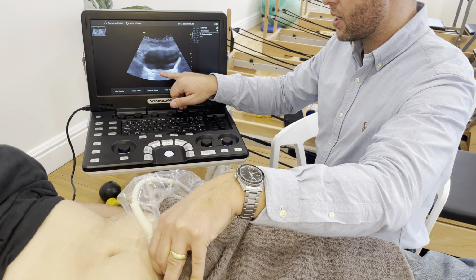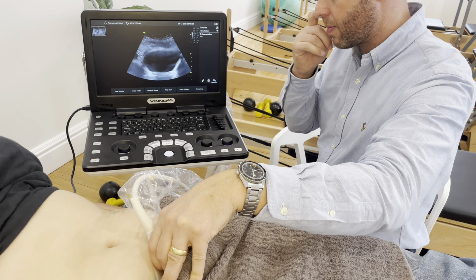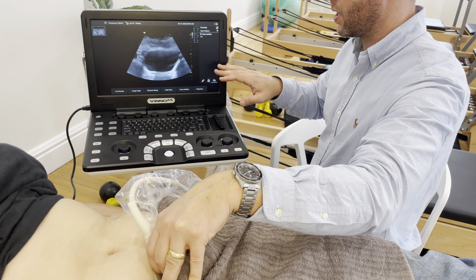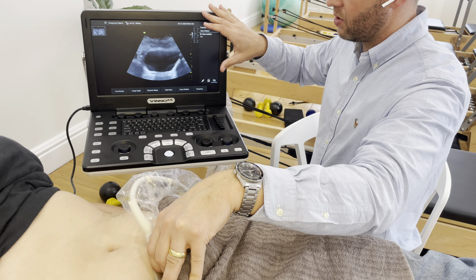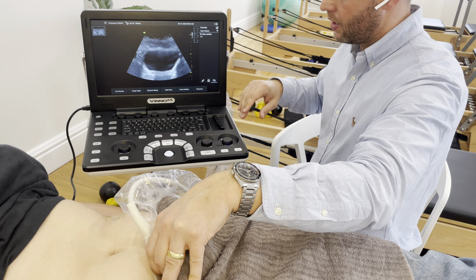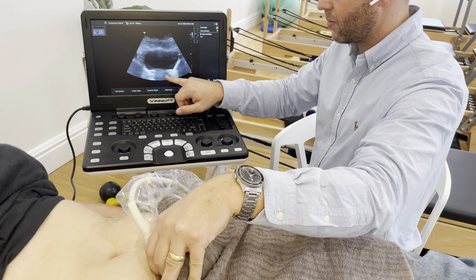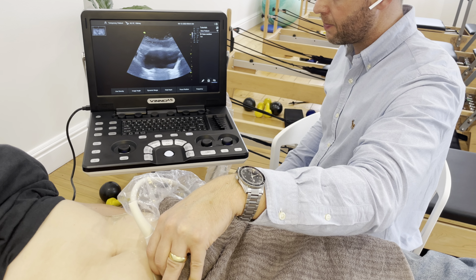So when we ask the patient to do a bladder contraction, we're looking to see what happens at the base of the bladder here. Usually I'm going to get the person to just do some, yeah, I see a little bladder elevation there, but let's just do some relaxed breathing first of all. With a deep breath in, we usually see the bladder drop, and with a breath out, we see the bladder come back up. Okay. And then when you're ready, just do a little pelvic floor contraction first, and we see that elevation or that little bit of doming right here at the base of the bladder.